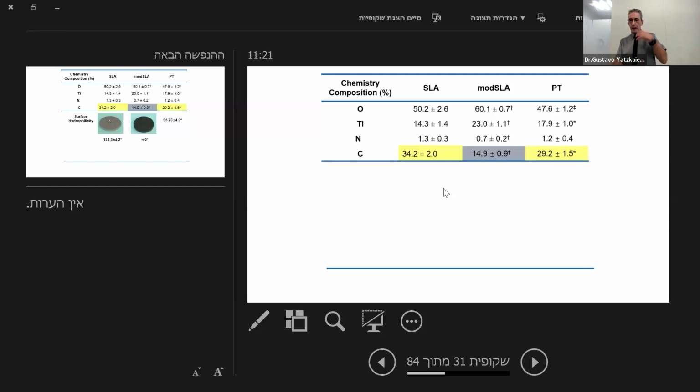Some of them put the implant in saline in order to preserve this property. Some of them that are working with salt, it's not necessary, the implant can dry, but you need to take into account that the factory produced the implant, it is sent to the distributor who puts the implant on the shelf, afterwards they send it to the clinic, and we put the implant on our shelves in the clinic, and we don't know what will happen with this property. The goal is to change this surface in our clinic in order to avoid this decrease in the property.